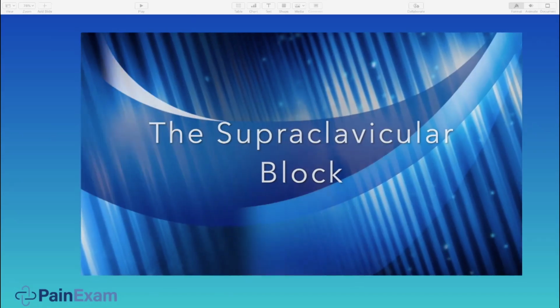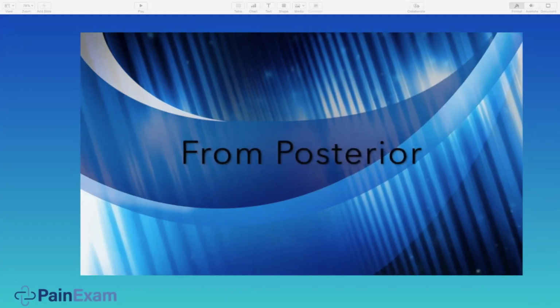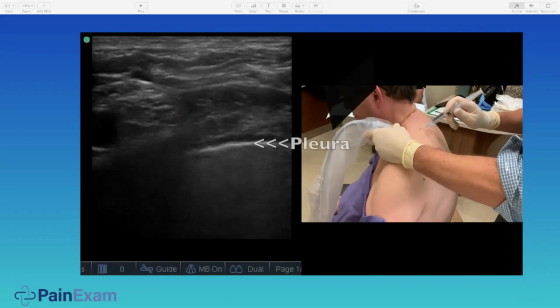So this is a movie I created. Some of you have probably seen this already, especially those of you from my department. It goes over my way of doing the supraclavicular nerve block in the office versus the way they do it in the operating room. I think it's quite important to show the different approaches and the considerations. In the operating room, you're using a large volume of local. In the pain office, I'm using a smaller volume and have the patient sit up.